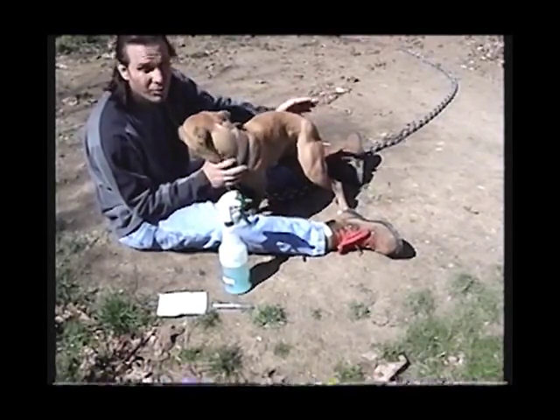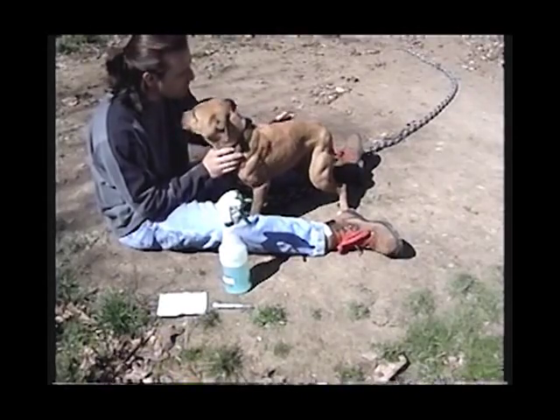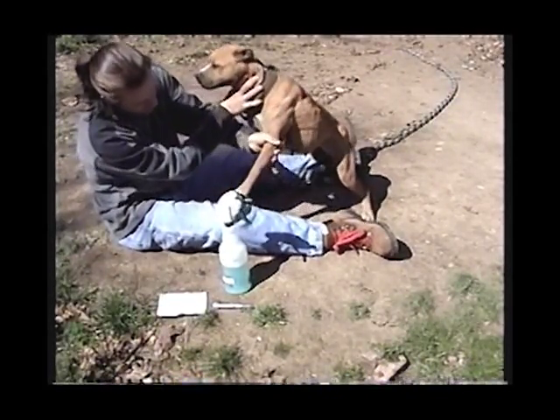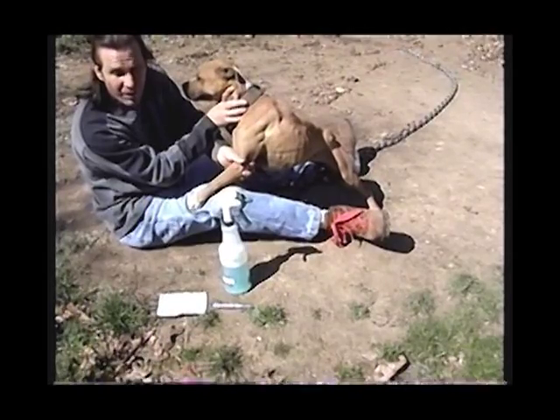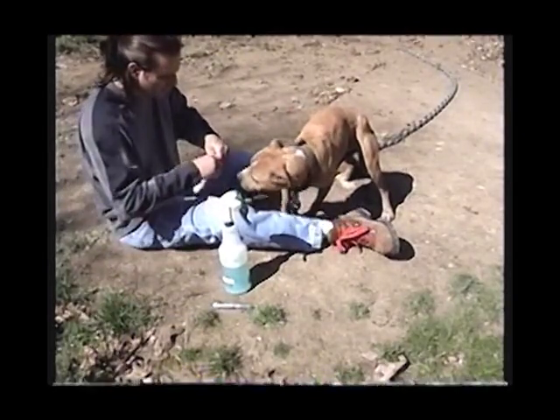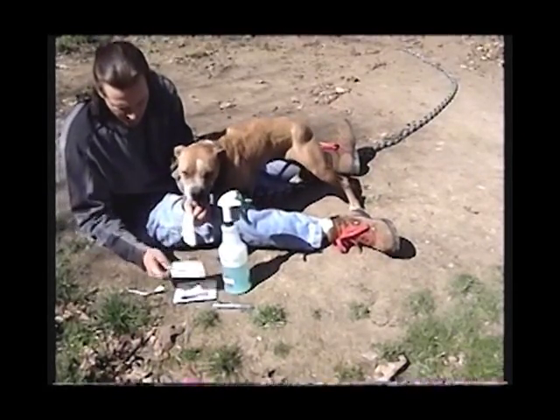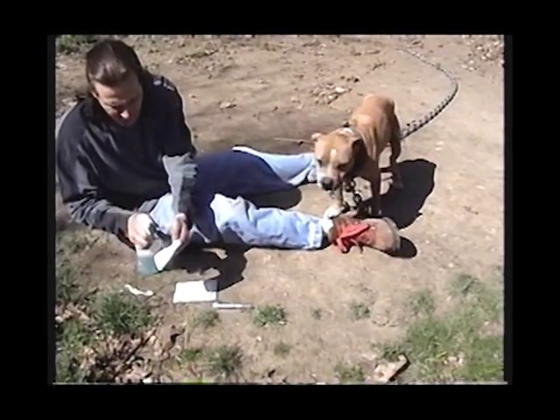Whether you're having a second hold your bitch or whether you're by yourself and have put in the time necessary to make your bitch manageable, the procedure is basically the same. I just hold the bitch like this by the arm. You have to prep the area — get that vein ready and then draw the blood. First, you want to prepare the area. Take a dressing sponge. You can use betadine or alcohol, whatever you want to use, but you want to disinfect the area before you start sticking things in it.